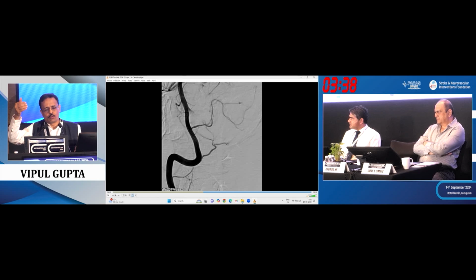So if you don't do a focal occlusion, you can't coil the whole artery. Yes, it was true proximal. Young man. Very interesting. It was like mid-20s, 30s. Very nice case, huh? But just wanted to show how Synchro can really help at times.